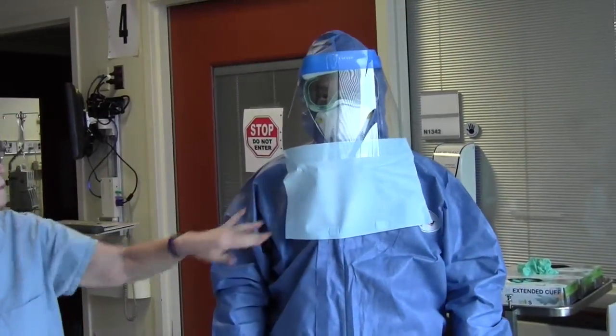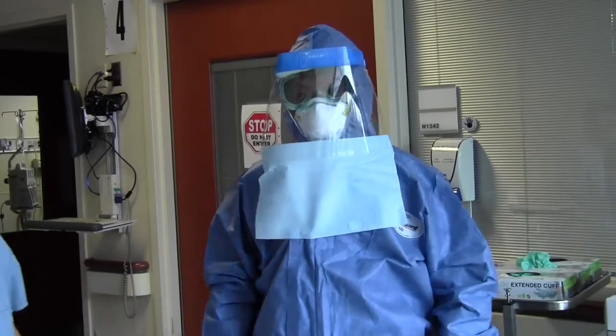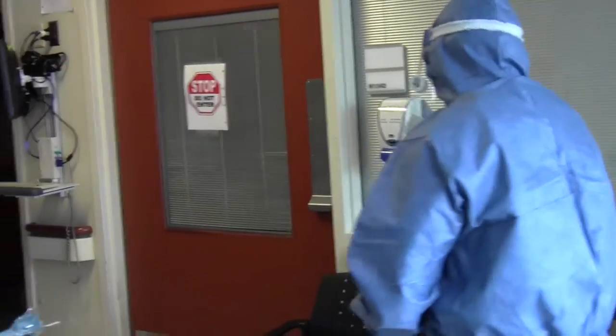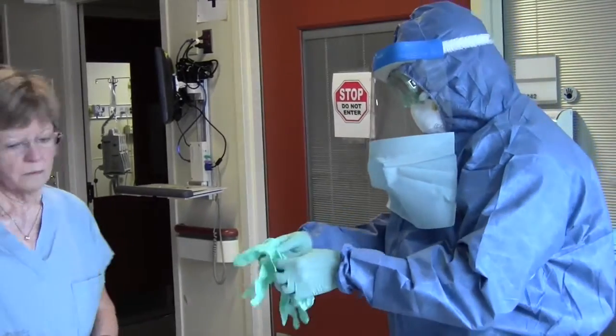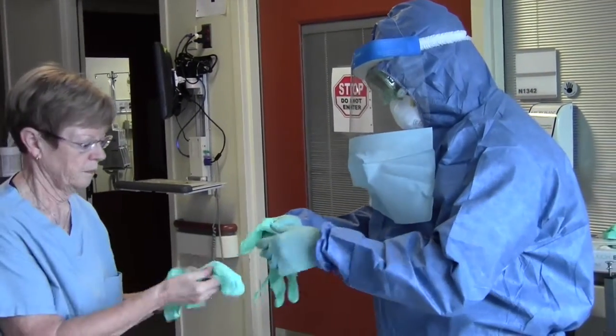Step 11. Put on second pair of nitrile gloves. The PPE observer will assist the clinician with the donning of the second pair of gloves over the coverall sleeve.